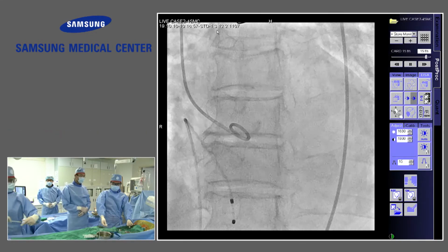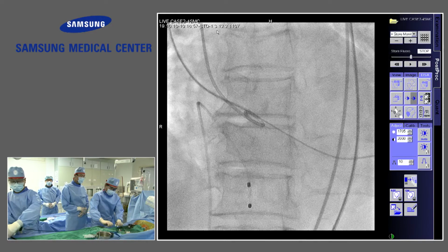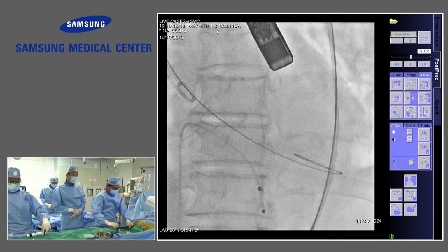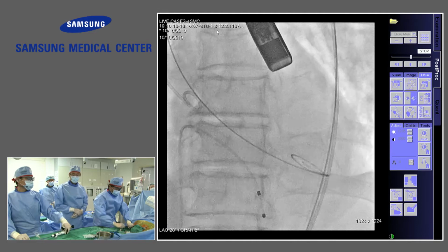We're not talking just about this patient; in general, the common practice in the very near future is going to be doing the whole coronary treatment before you do the TAVI procedure. But this is just for the sake of discussion, so go for it and show us your skills.